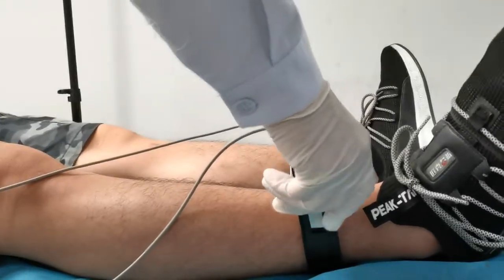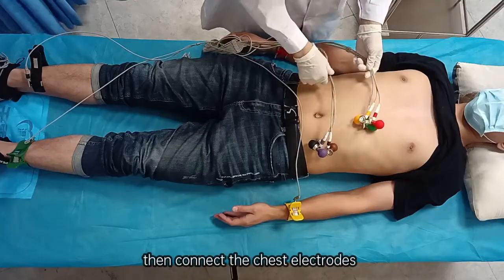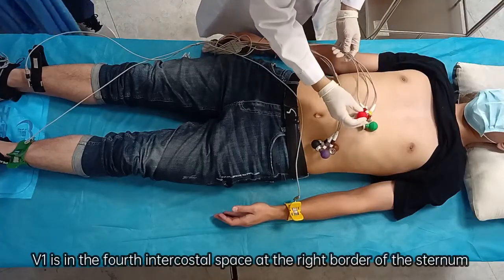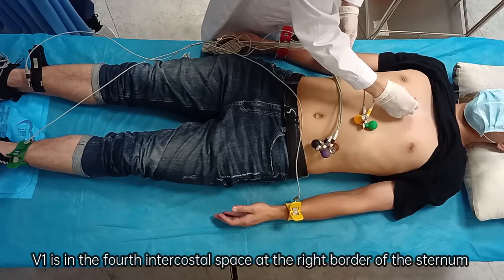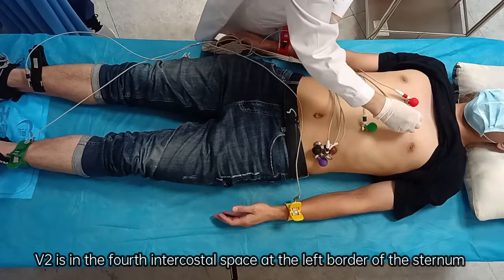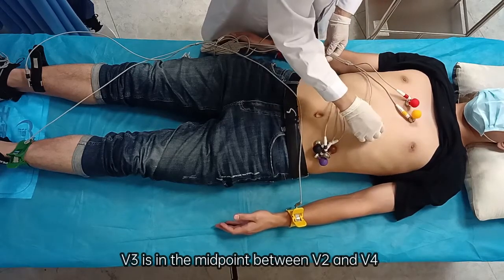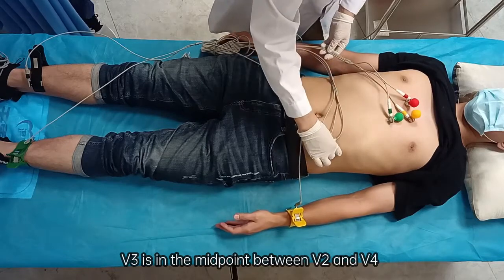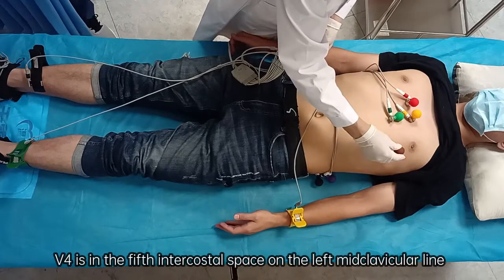After the limb electrodes are connected, connect the chest electrodes. V1 is in the fourth intercostal space at the right border of the sternum. V2 is in the fourth intercostal space at the left border of the sternum. V3 is in the midpoint between V2 and V4 — connect V4 first. V4 is in the fifth intercostal space on the left mid-clavicular line.